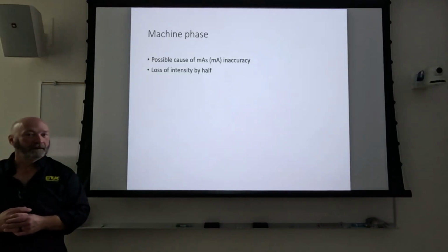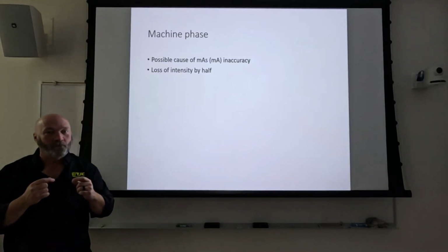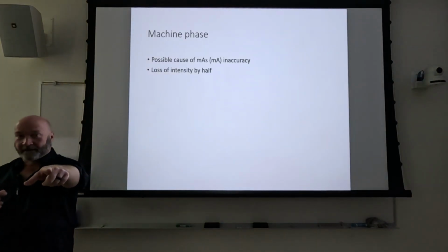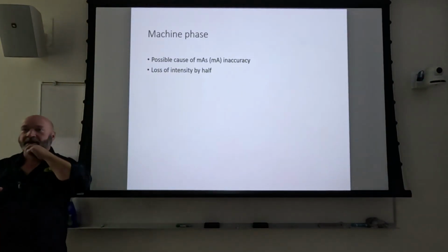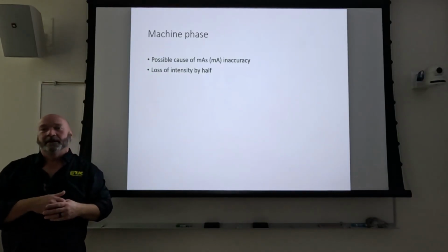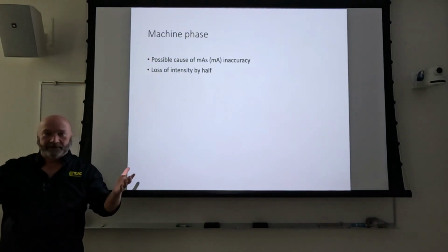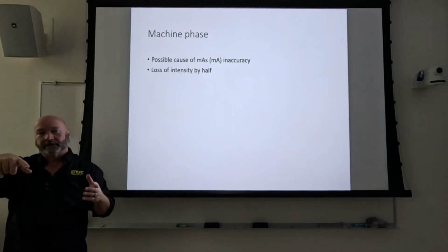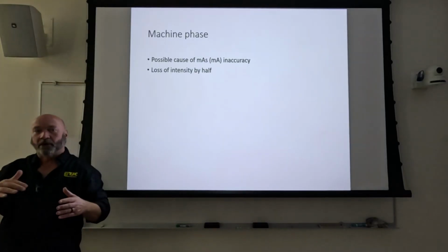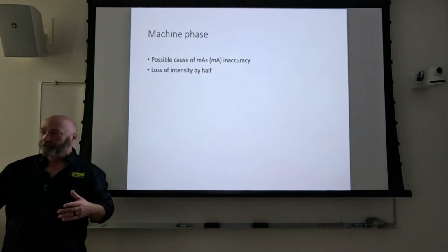Say again? Generator? The generator specifically. One more time. The rectifiers? You're on it. The voltage ripple. Okay, let's say for this hypothetical situation, we're using single phase. You're not going to be using single phase, but this is easier to walk through. You're using single phase, right? So all of a sudden, half of those pulses are gone. Did you say it? Yeah. Rectifiers. You blew your rectifiers.